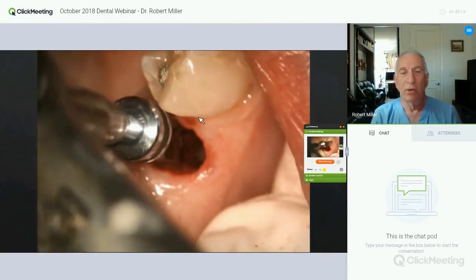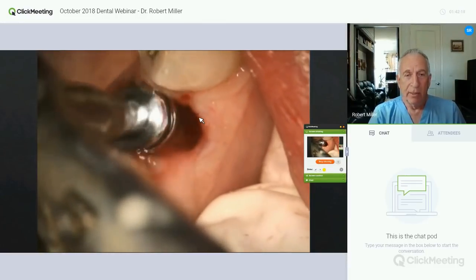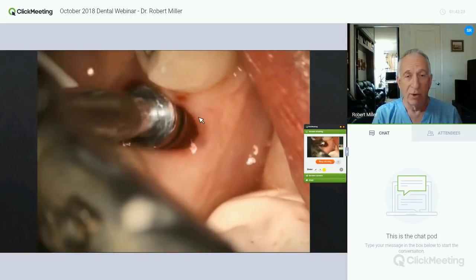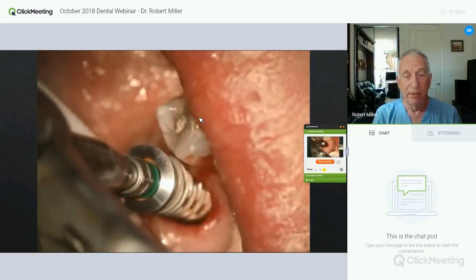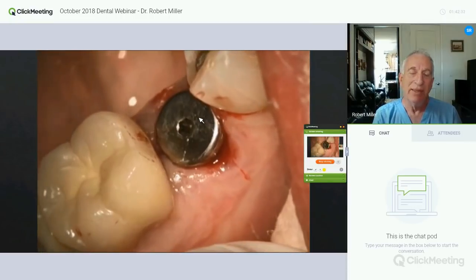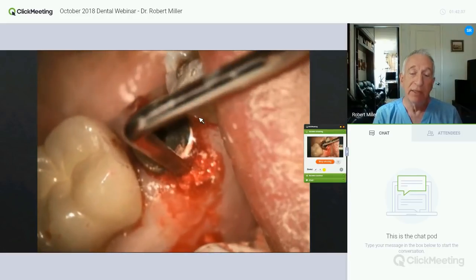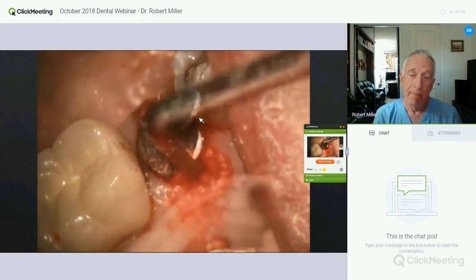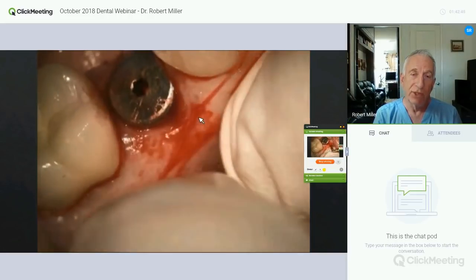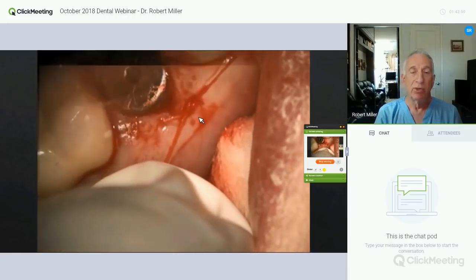So when we are placing implants, I love doing extraction immediate implant placement. This is the final drill. In fact, in some of these cases, the defect is large enough, so we just go to a final drill. This is an Envision OS implant from Intralock. It's got a calcium phosphate surface. Into the gap, we place calcium phosphate, in this case, Cerasorb M. We just put one little suture in there just to close off the gingival margin. And then we re-enter this at 2 months, and we start to restore it.